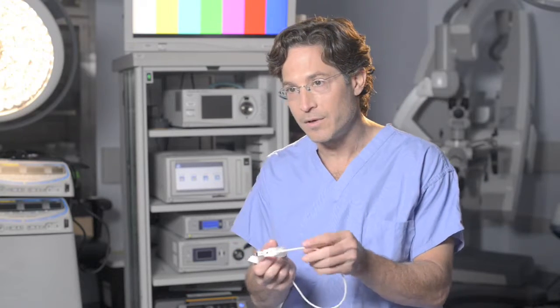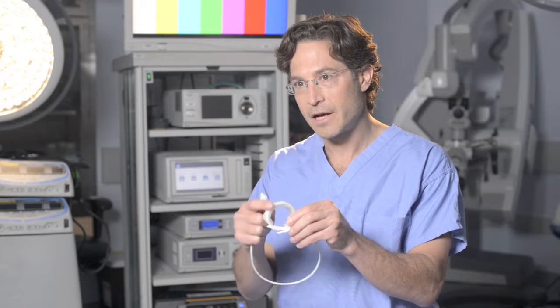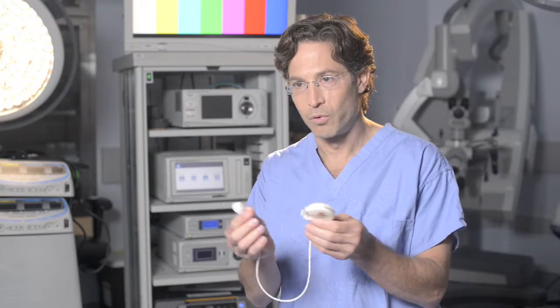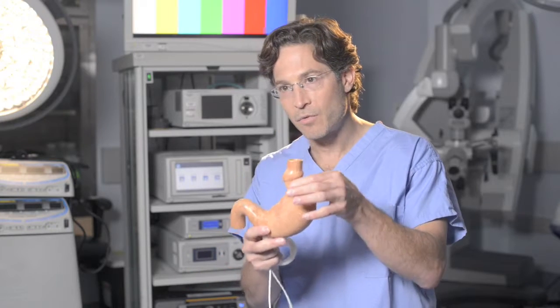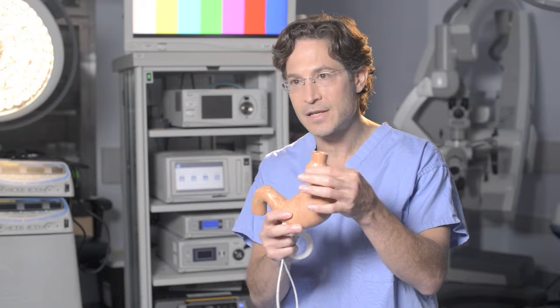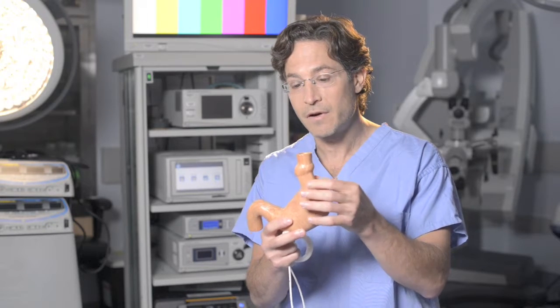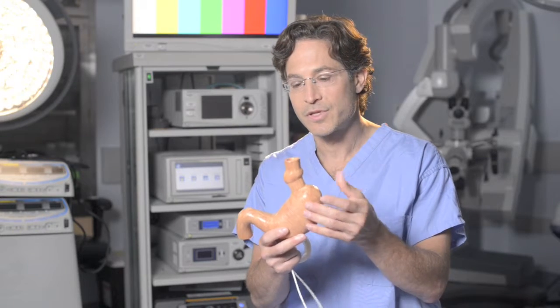So the lap band, which this is exactly the band that we use, is an inflatable cuff on the inside of a silicone ring connected by tubing to a little port. And what we do is we put this band around the upper portion of the stomach, just below the top of the stomach, centering on this very sensitive area of our stomach. This model is very accurate in terms of the shape of the stomach, although smaller than our actual stomach.